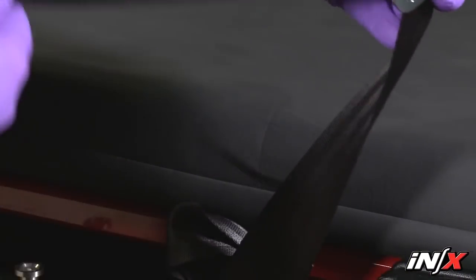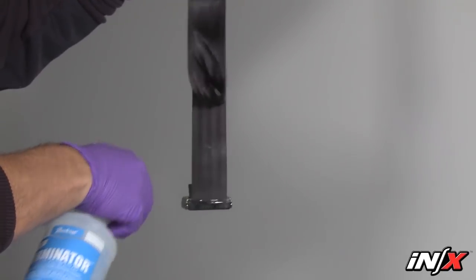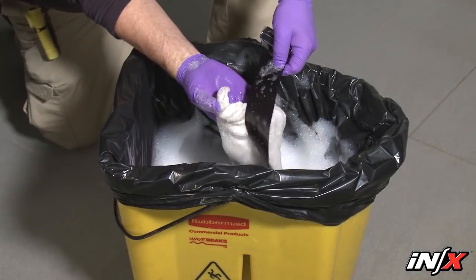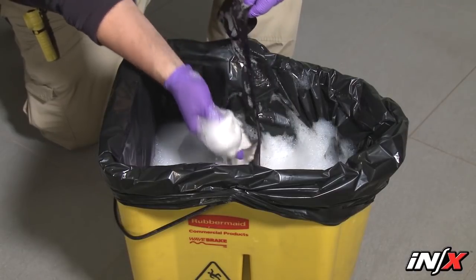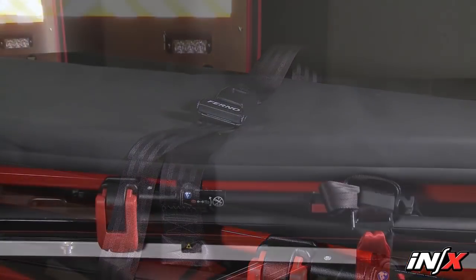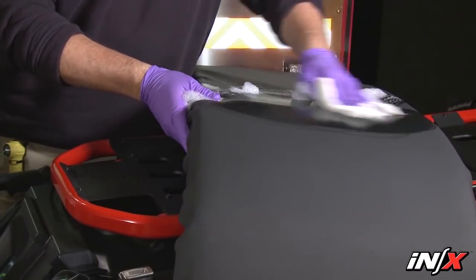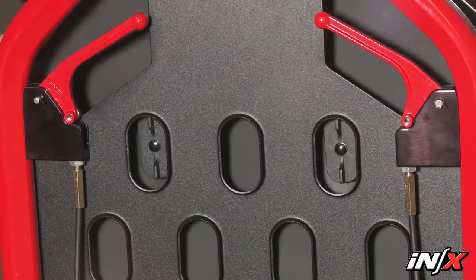To disinfect the restraints, first remove them from the NX. Spray the metal buckles and slide bars with a disinfectant cleaner following the disinfectant manufacturer's instructions for application method and contact time. Do not immerse the buckles or slide bars in liquid. Hang the restraints to air dry if needed. Attach only clean dry restraints to the NX. To clean the restraints, immerse the restraint webbing in a solution of mild soap and water. Don't immerse the metal buckles or slide bars in the solution. Repeatedly dip the webbing in clear water to rinse. Hang the restraints to air dry and attach only clean dry restraints to the NX. To disinfect and clean the pad, remove it from the NX, apply disinfectant following the manufacturer's instructions. Use a soft cloth to wash with warm soapy water. Rinse the pad with clear water and dry with a towel or hang to air dry. When done, attach the pad back on the NX.